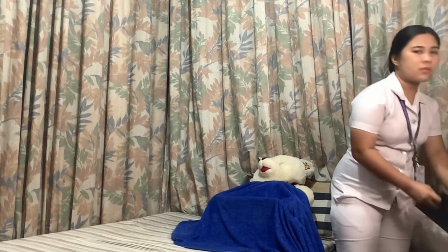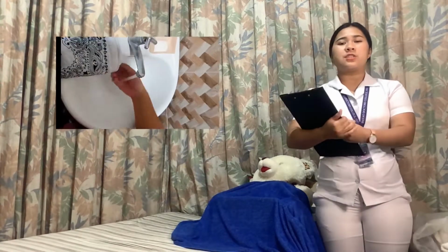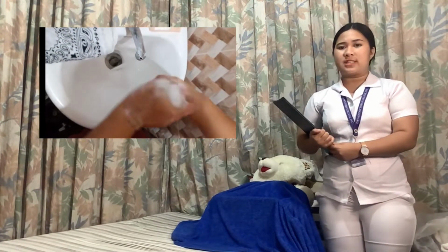First thing we do is to check the doctor's order for catheterization. This is to ensure that we will be assessing the correct procedure to be done with the right patient. Okay, so wash hands before preparing the set. This is to deter the spread of the microorganism.